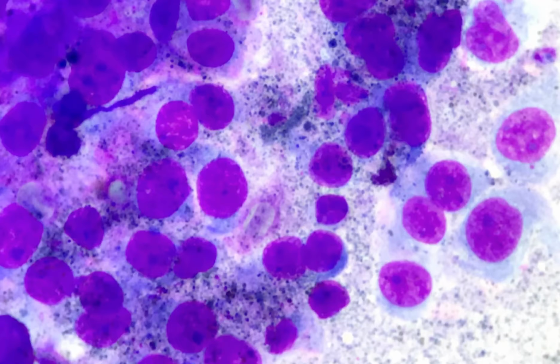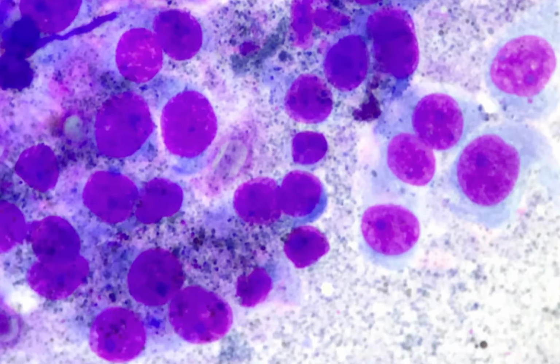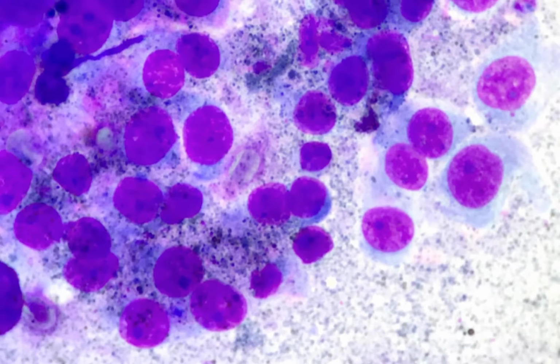So in general, melanoma is a highly pleomorphic tumor. It can appear like a discrete round cell tumor, sometimes it can appear like an epithelial tumor, and mostly it does appear like a mesenchymal tumor also, because here we are able to see that some cells do appear like mesenchymal cells.